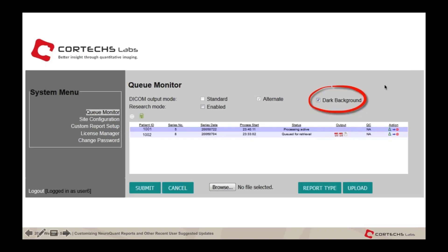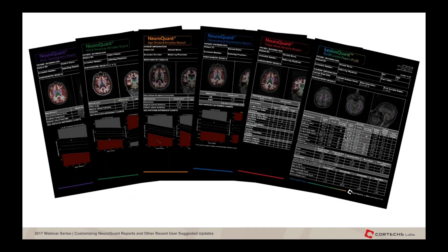This only applies to future reports — if you have a report already created, selecting dark background will not change it. You would have to reprocess using the dark background check. The white background reports are still available on the user interface for faxing or printing. On the user interface there is a new checkbox circled in red that says 'dark background report.' Once selected, all reports from that point forward going to the PACS system will be created with the dark background, while PDFs available on the system will stay with a light background.